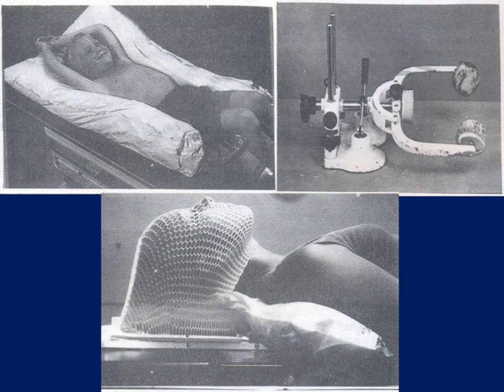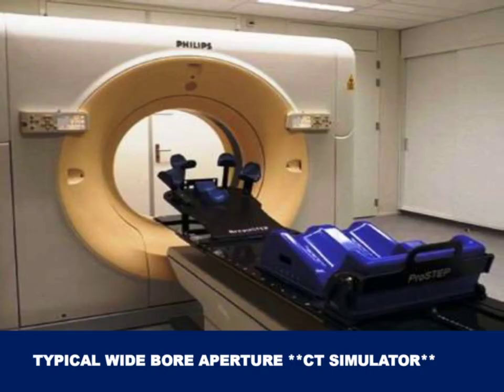So you see in this diagram, a typical CT scan image: we acquire the CT simulation and contour slice by slice all the tumors serially up and down, picking up the central slice and including the margin. Then you can collect a volume of data, and then you put a DRR. When we combine all the CT slice images and get the DRR image, it's all by the help of a 3D treatment planning system, a very costly system. Typically we ask for 5 millimeter slice thickness in head and neck cancer and 10 millimeter slice thickness for chest, trunk and pelvic tumors.